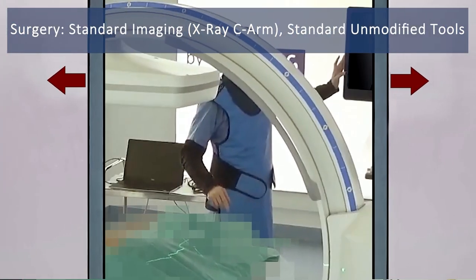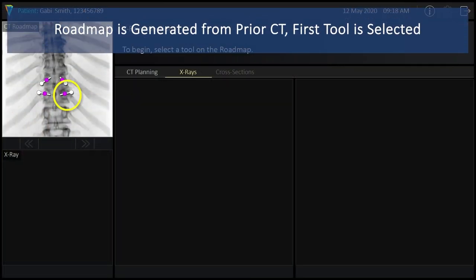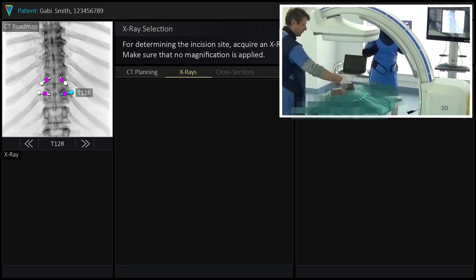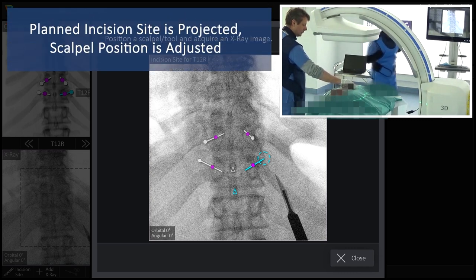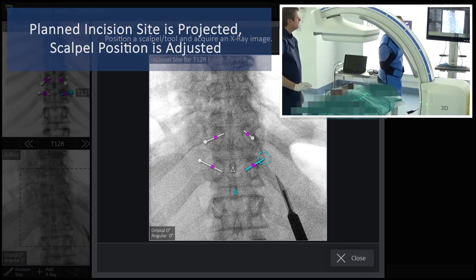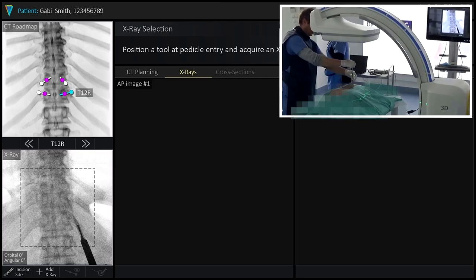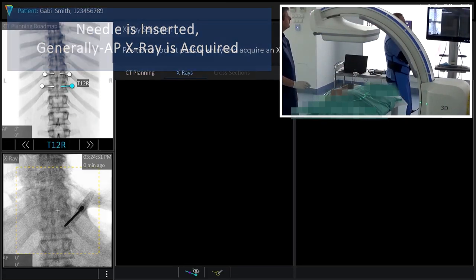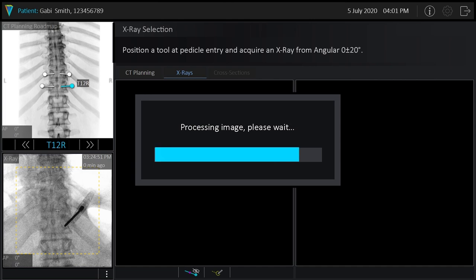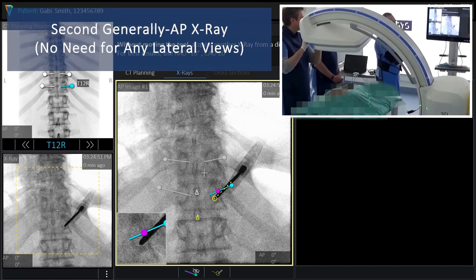That planning is now married to the CT data — it becomes part of the CT data. In the OR, we generate a roadmap image from the CT showing all the planned tools. We do them one by one or two in parallel. First we do the incision — you see the scalpel relative to the planned incision site, so you know where to make the incision. Then we start the insertions, with a generally AP view — can be a bit caudal, cranial, RAO, or LAO.